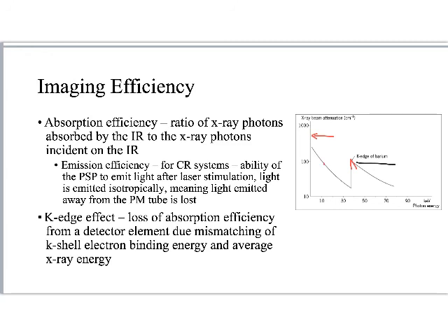So you can see they were sampled at a rate that was below probably what was occurring. Then once we hit the K-edge, it bumps up and we start sampling at a higher rate again, right? That's a problem, because anything just to the left of the K-edge was potentially undersampled, right?